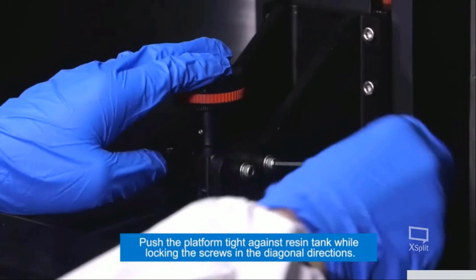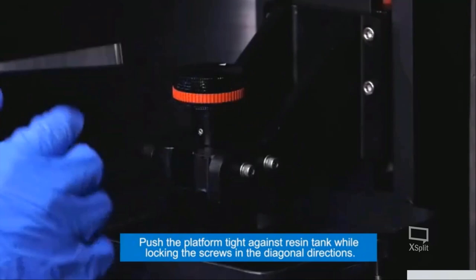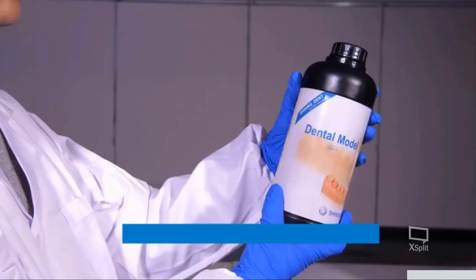As you can see, push down the platform, then lock the screws in the diagonal direction. This is very, very important in order to have the first layer in contact with the plate. Otherwise, the model will fall down and you will have a failed print.